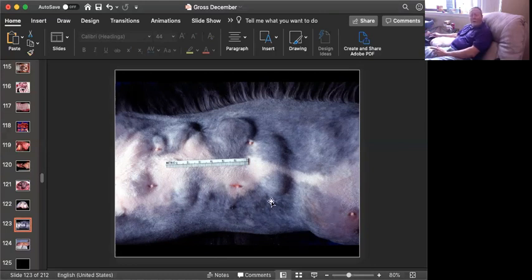You'll see the big ulcers here. I really probably wouldn't put this in the camp of mammary carcinoma. What this particular condition is, is fibroepithelial hyperplasia of the mammary gland. This is a great paper that was written back in the 90s. It's in VetPath. You should be familiar with this.